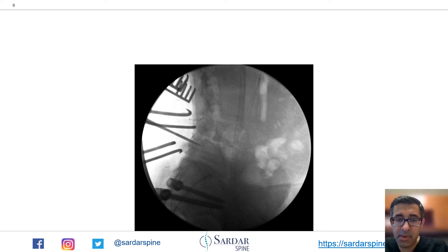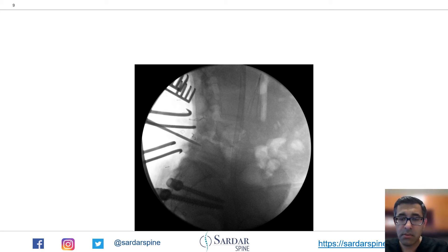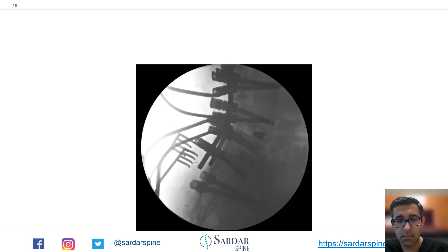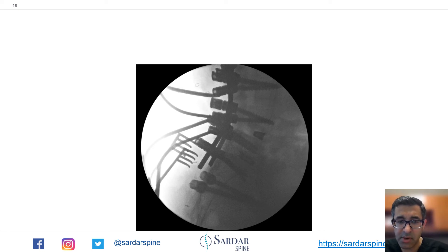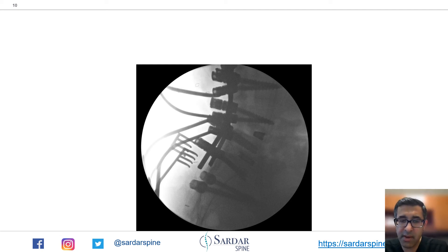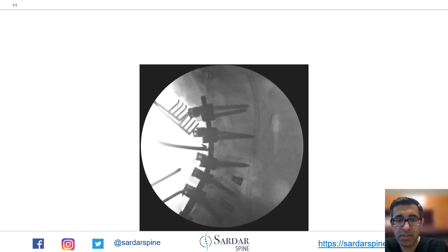The first step after exposure was to put screws in — iliac screws and then segmental fixation at each level. Next, I put temporary rods in to use them to reduce the spondylolisthesis at L4-L5. You can see the temporary rods here. I then performed the interbody fusions at L5-S1 and L4-L5. I then placed my permanent rods in place, and used compression from L3 to S1 to get the lordosis needed for this patient.